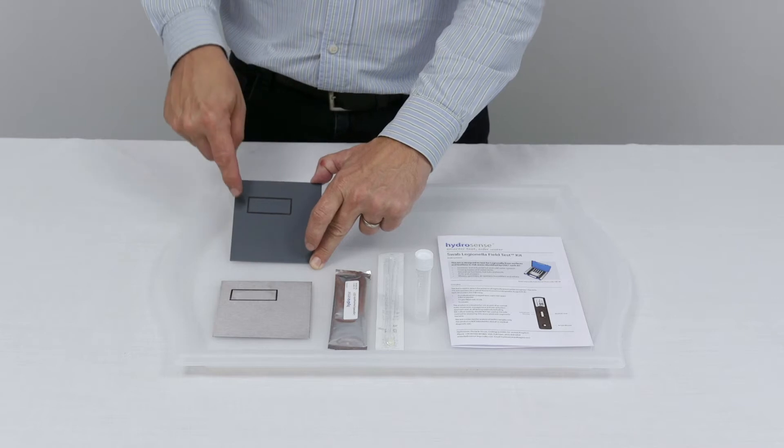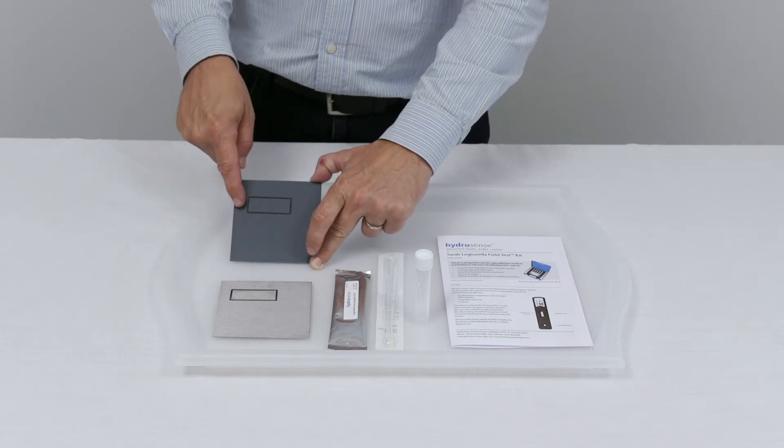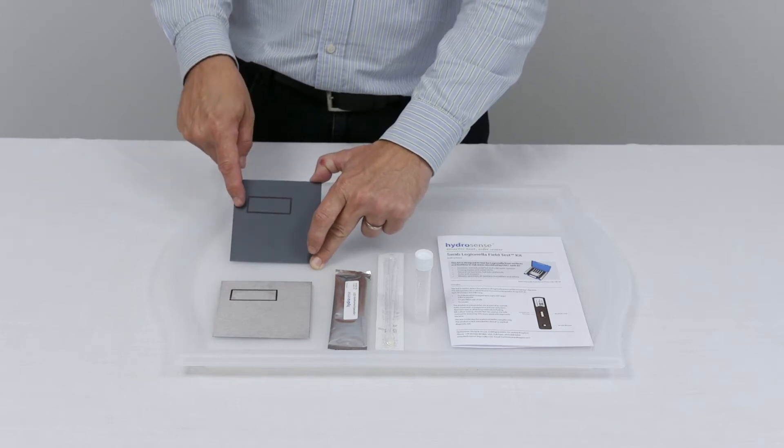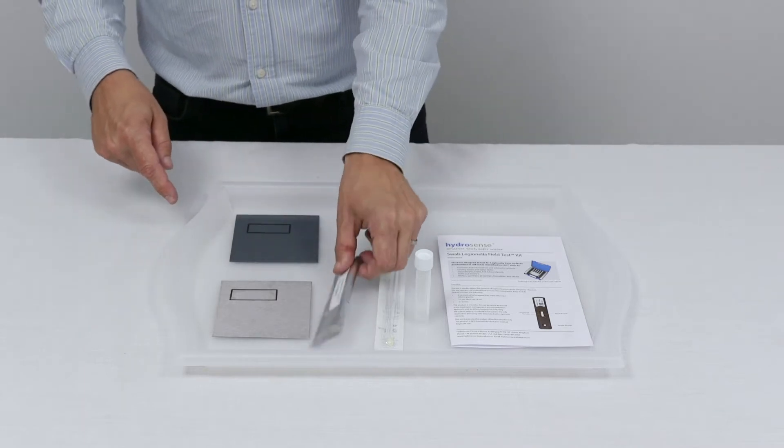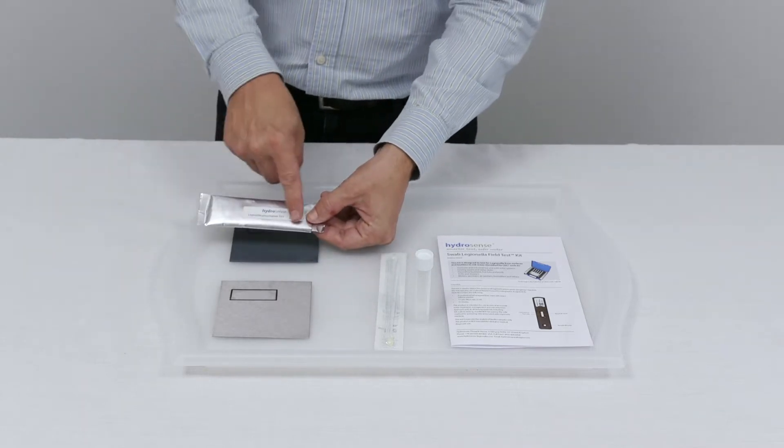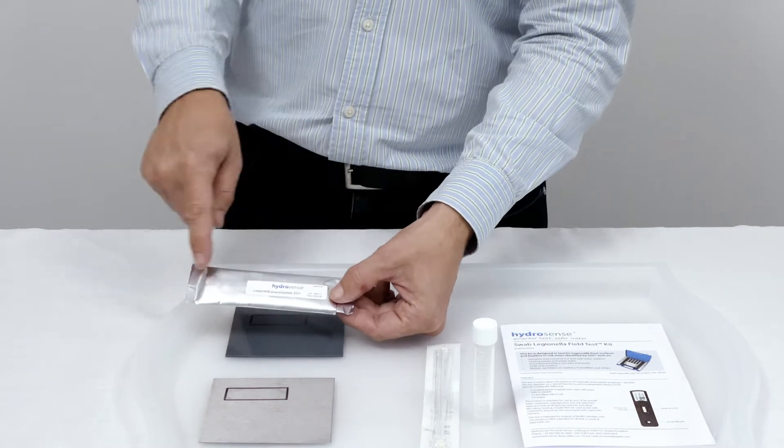The sample size and swabbing area should be 10 centimeters squared. I've marked a rectangle here which is five by two, which is 10 centimeters squared. That's approximately the same size as the label on the front of the foil. You can sample larger areas, but the minimum size of 10 centimeters squared must be sampled.